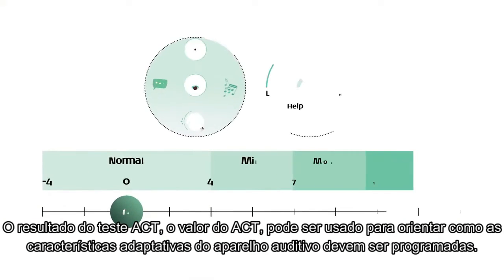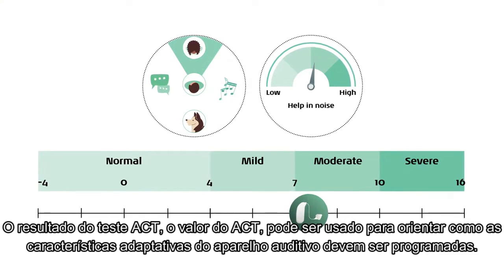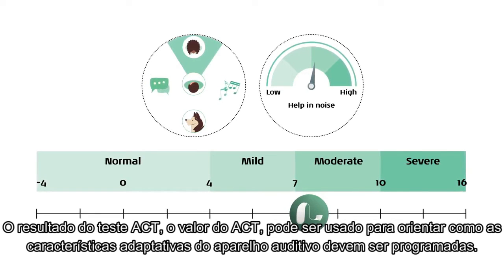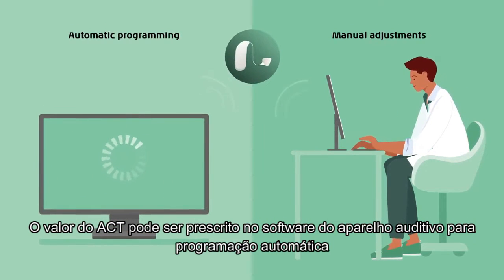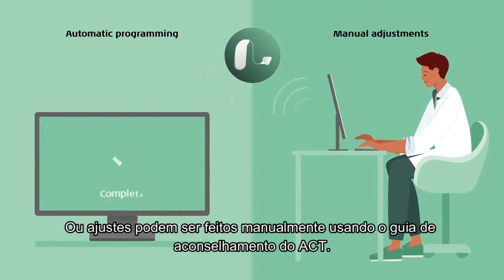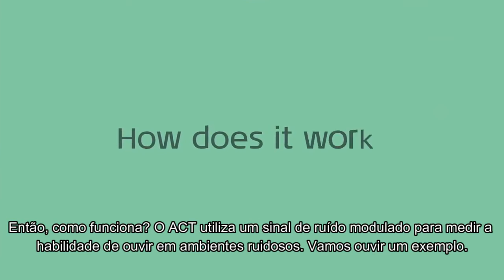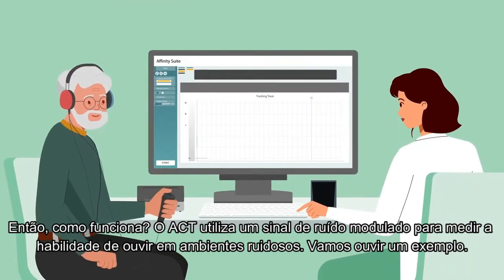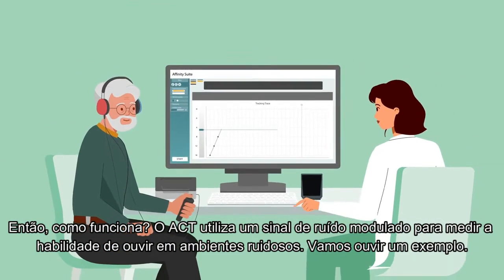The result from the ACT test, the ACT value, can then be used to guide how the hearing aid's adaptive features should be programmed. The ACT value can either be directly prescribed into the hearing aid fitting software for automatic programming, or adjustments can be made manually using the ACT counseling guide. So how does it work? ACT uses a modulated noise signal to measure hearing in noise ability. Let's listen to an example.